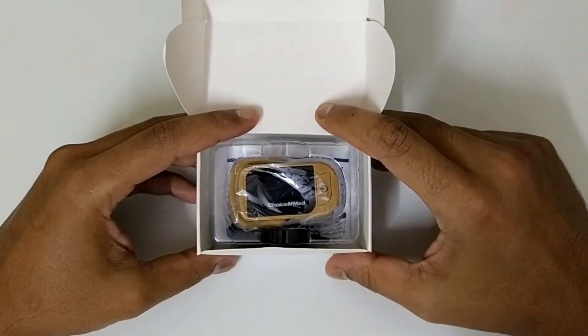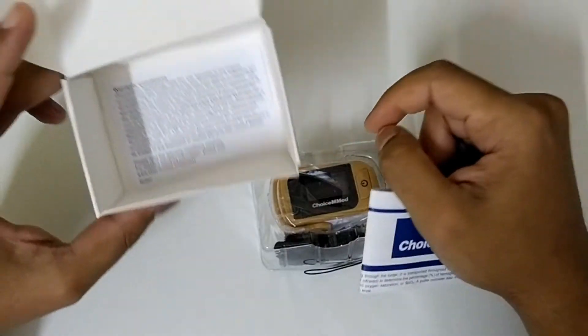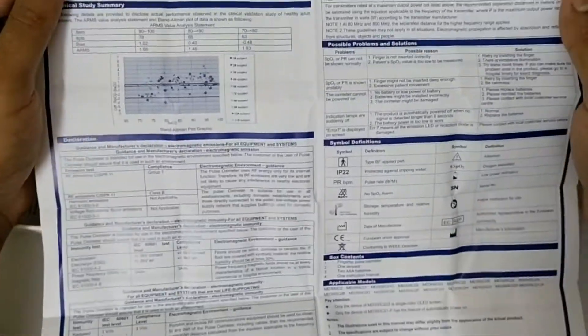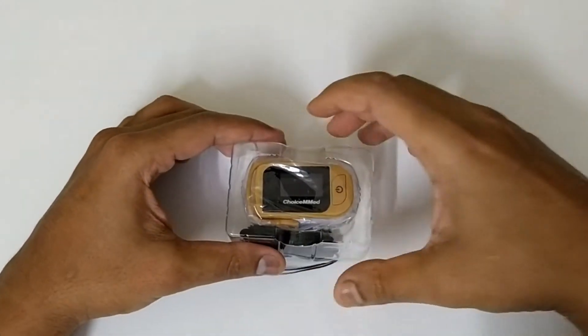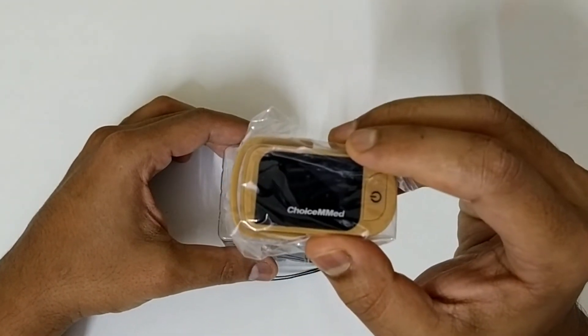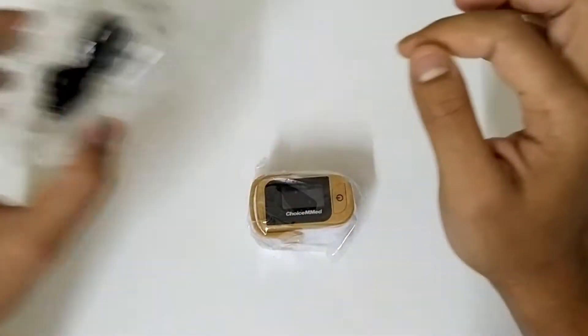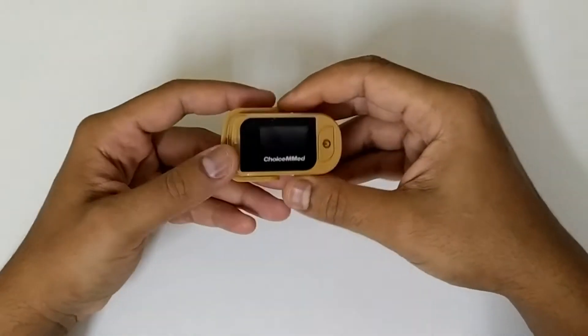It's a very small package. Removing the device, you will get a small warranty card as well as an instruction manual. The instruction manual is very detailed and gives thorough instructions on how to measure your oxygen levels. You also get two AAA batteries, which I've already installed, and a lanyard so you can hang it around your neck for convenience.